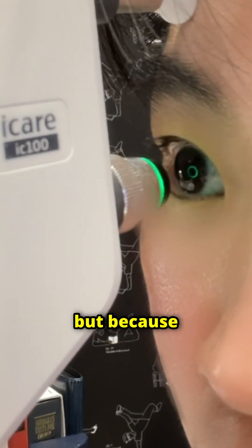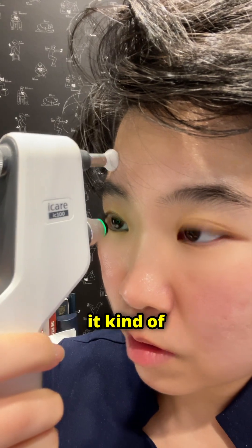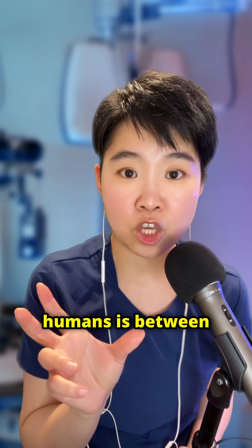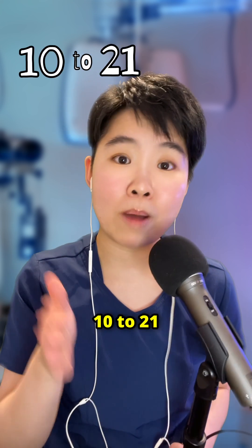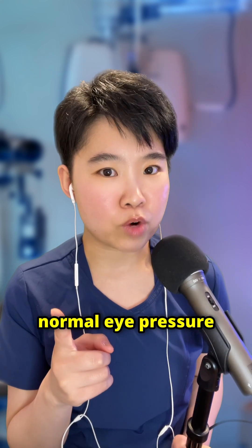I can still feel the tip touching my eye, but because the area of contact is so small and it happens so fast, it kind of feels like someone just brushed my eyelash. The normal range of eye pressure in humans is between 10 to 21 millimeters of mercury. But does anyone know what the normal eye pressure for frogs is?